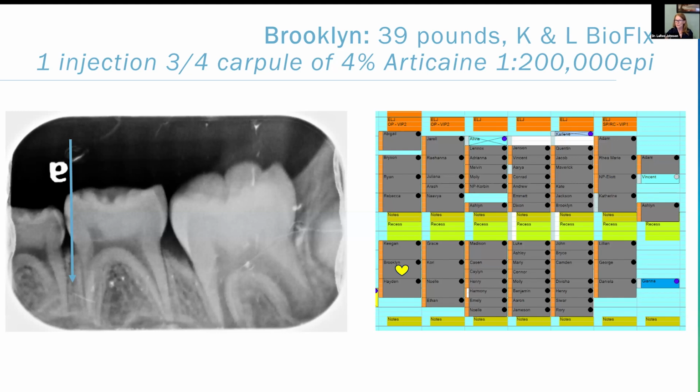We know that the drift is better mesial, but she was a little bit of a fussy one, and I felt much better about being very predictable, dropping in right there. I really wanted the raincoat on this tooth so I could keep everything tidied up really nice, so I dropped in right there. Things went pretty well. And then I dropped in distal of it, and it was a little bit of a struggle bus, but I got in enough where I could put the raincoat on that partially erupted tooth 19, not even enough erupted to seal, but enough where I could complete those restorations and clean them up with the raincoat on.